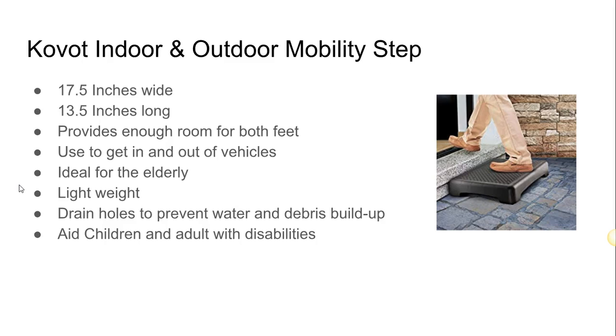It's ideal for the elderly and it's lightweight, so you can pick this up in one hand easily without feeling any weight. Another great feature is it has some holes on top that prevent debris and water from staying on the step.